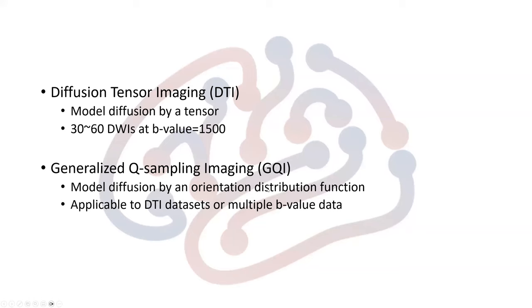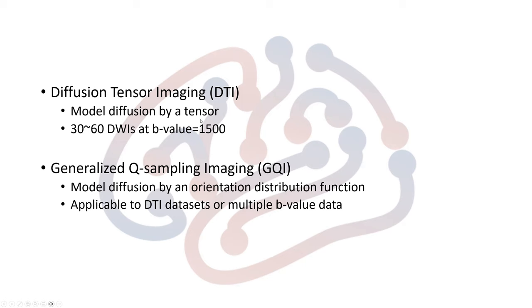For GQI, it's using a more advanced model to handle some limitations, and the method is also applicable to existing DTI datasets or more advanced datasets that include multiple B-values. So for a fair comparison today, we're going to use the same data but construct it using DTI and another using GQI.